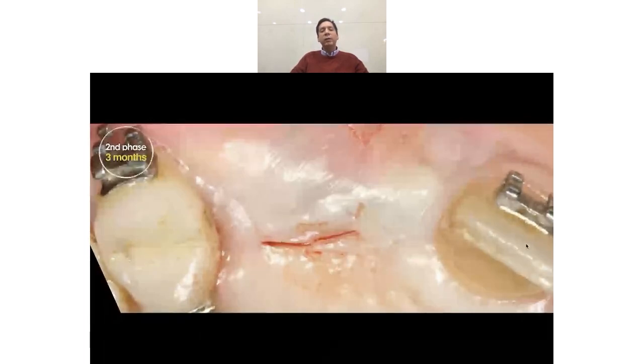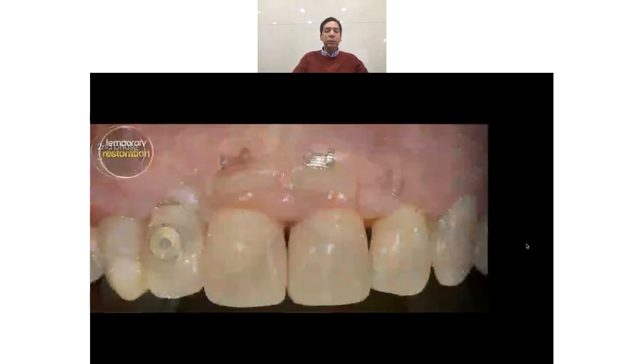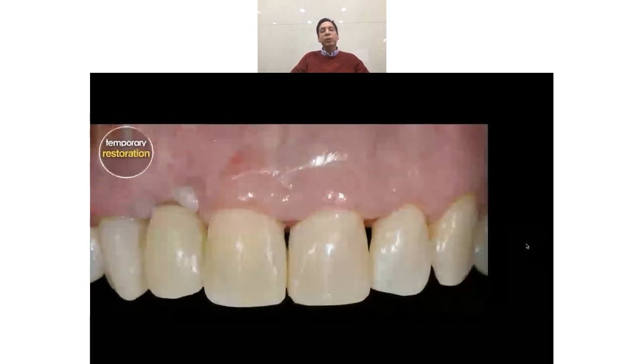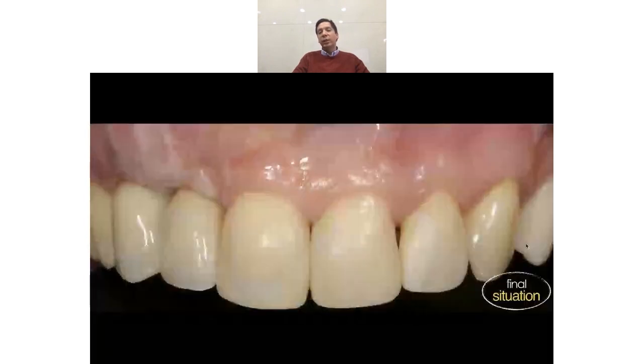We see that with only a small incision, we managed to remove the cover screw and we placed a transmucosal healing abutment. And this is the temporary restoration. We can see that now actually the implant-supported canine crown is smaller than the contralateral canine. We can see here the radiopacity of the regenerated bone. And this is the final restoration.